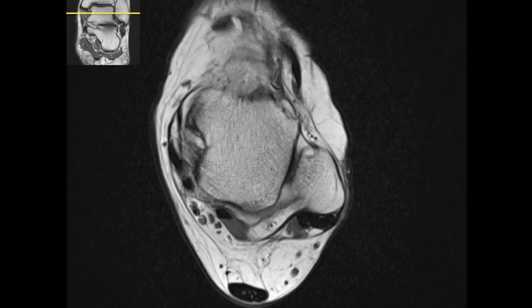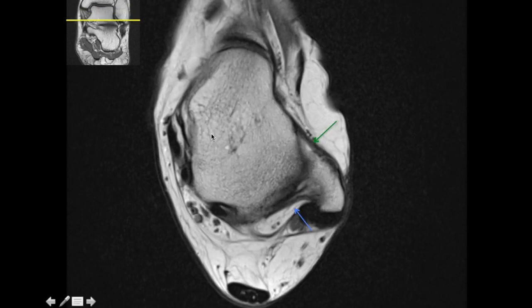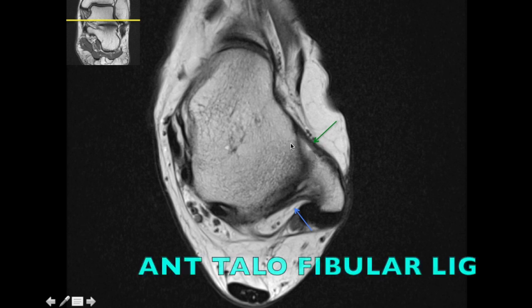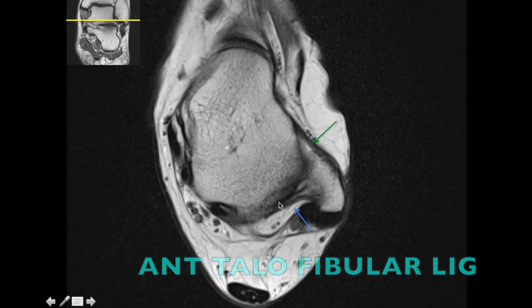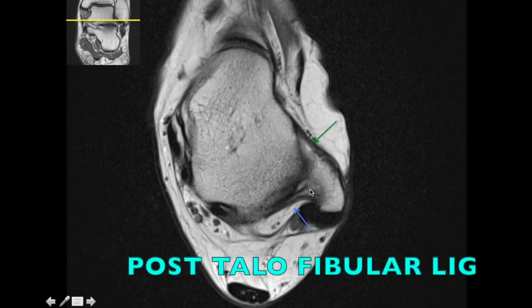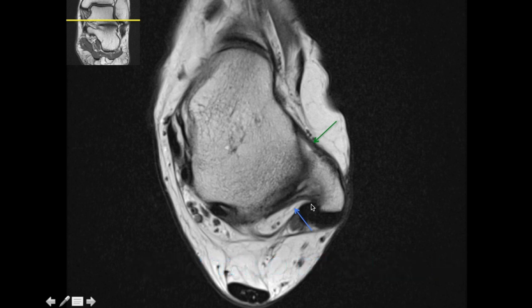Going further inferiorly, at the place where the talus has a figure-of-8 appearance, a thick band is seen between the talus and the fibula — this is the anterior talofibular ligament. Posteriorly, you have the posterior talofibular ligament. Some hyperintense signal with a striated appearance is seen towards the fibular attachment of the posterior talofibular ligament — this is normal and should not be mistaken for a tear. Remember, the posterior talofibular ligament is one of the last ligaments to get injured in ankle sprain.